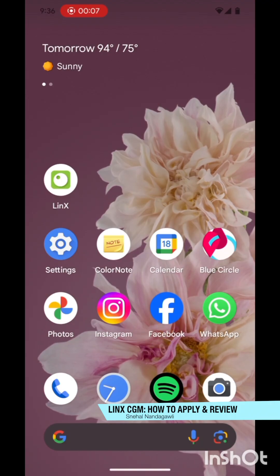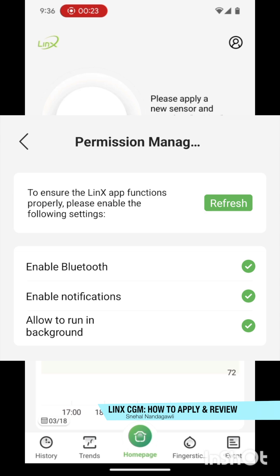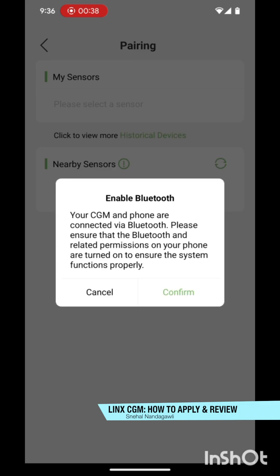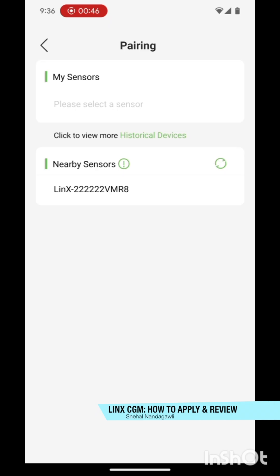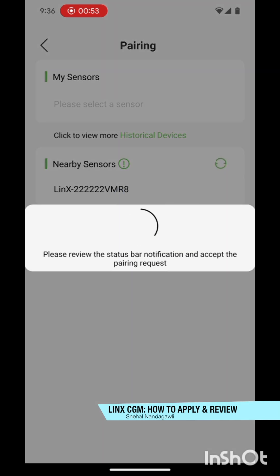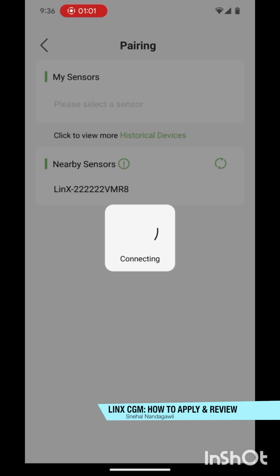The second part of the LinX CGM is the mobile app, called the LinX app, which is available on both Android and iOS. You click on it and it opens up — you have to pair the sensor with the app. I've already set up the necessary permissions. There are a couple of permissions you have to accept, and it's Bluetooth activated so you have to ensure your Bluetooth is on. Once Bluetooth is on, it will detect the sensor I just put on my arm. Then you click on the sensor name shown, click pair, accept, and let it connect.